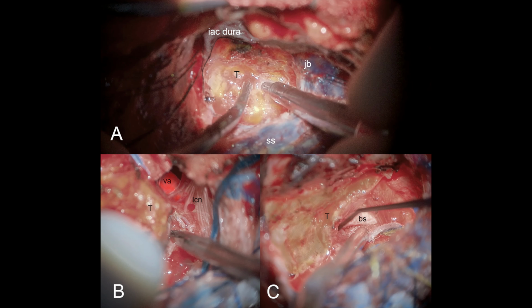In Panel B, you can see the lower cranial nerves labeled LCN and the vertebral artery. An arachnoid plane is carefully preserved between these structures and the tumor's inferior pole. In Panel C, the tumor is being gently elevated off the brainstem, maintaining the delicate arachnoid layer that protects the small perforating arteries on the brainstem surface.